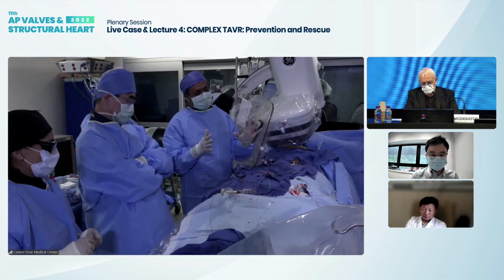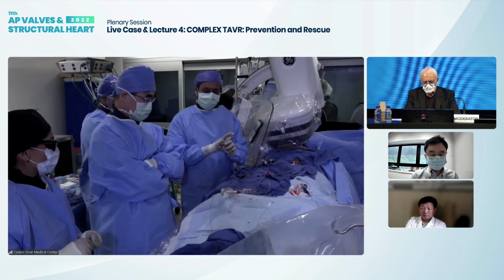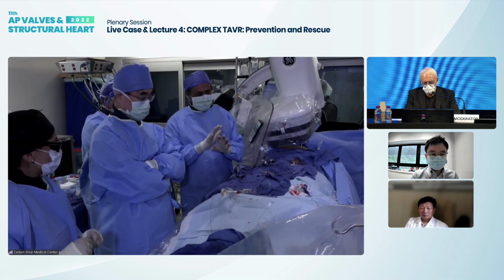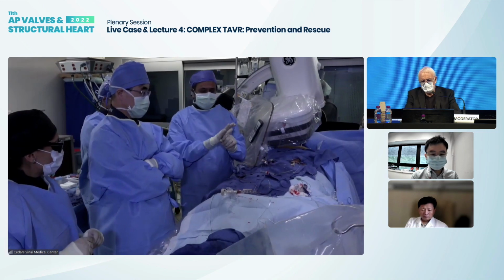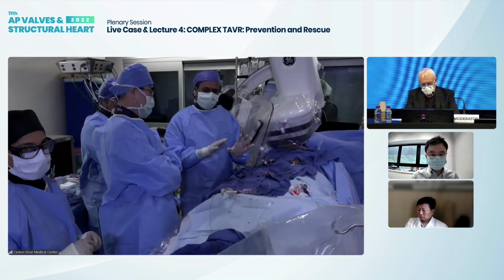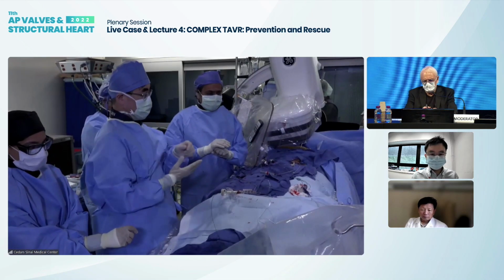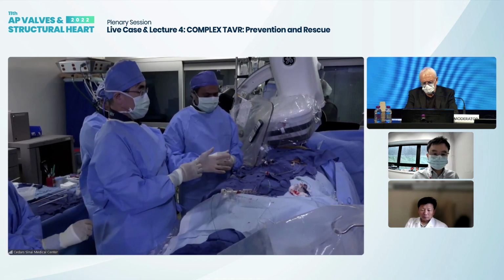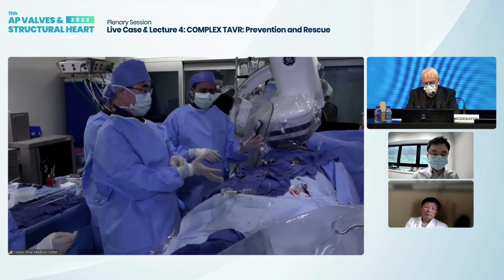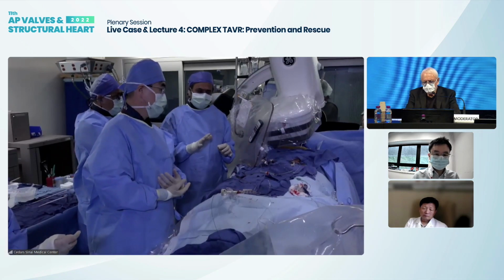26, we feel, and we have to be very careful and conservative here as we go up. And if it requires 2 balloon dilatations, that's what we will do. Yeah. We'll go up slowly. So Dr. Galley is going to go up slowly. He's also going to look at the pressure gauge, all right? Yeah. So if you reach 5 atmospheres, we may back off a little bit, okay? And then, if necessary, we will go back up again. Yeah. So, I think when you go up too fast, you increase the risk of root injury. Yeah. We are also going to pre-dilate here, which should facilitate the crossing of the valve system. And hopefully, that may also lessen the chance of aortic root injury.